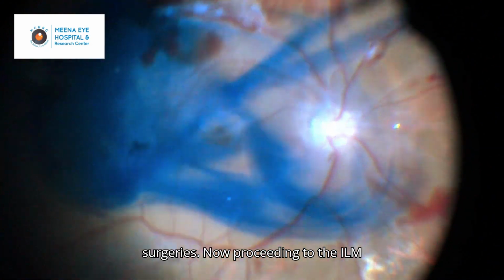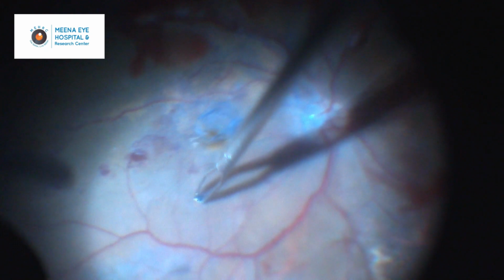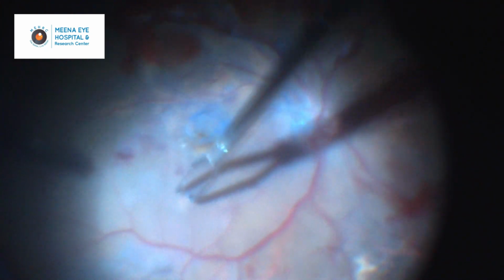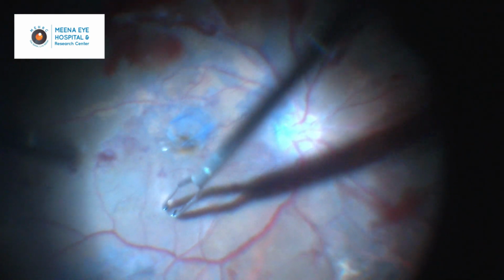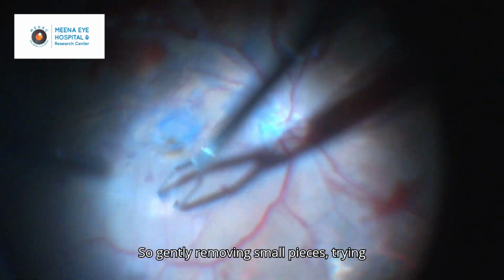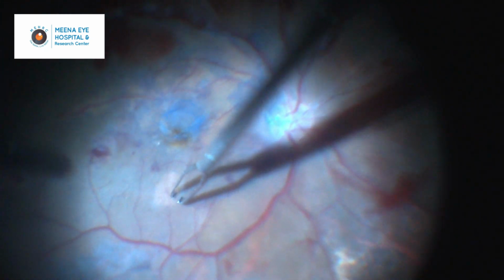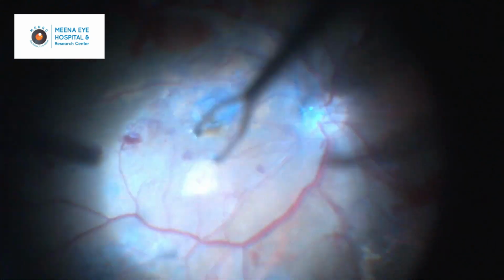Now proceeding to the ILM peeling, so staining it with the brilliant blue-green dye. So this is the pinch and pull technique that I use. This is the Grieshaber forceps by Alcon. So gently removing small, trying to get a flap, and this pinch and pull technique is what I prefer for ILM peeling.